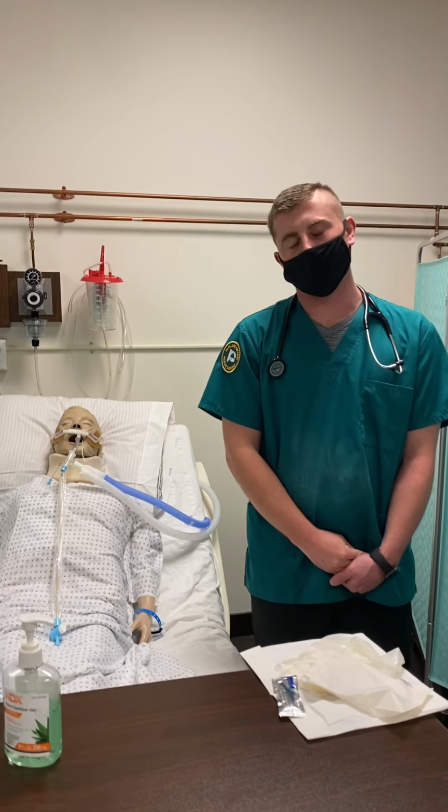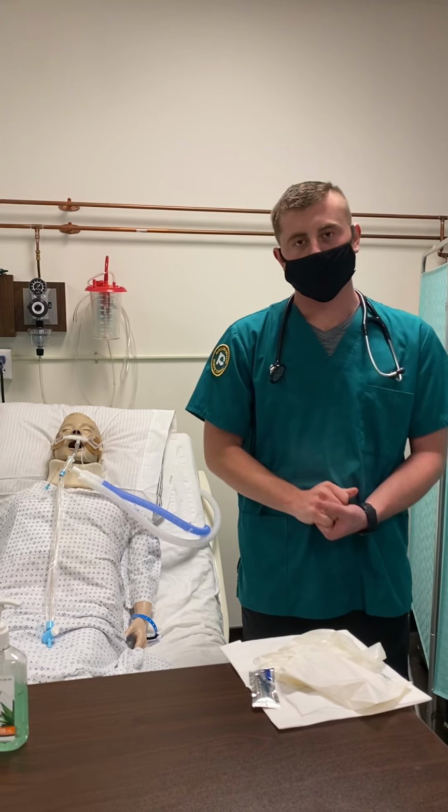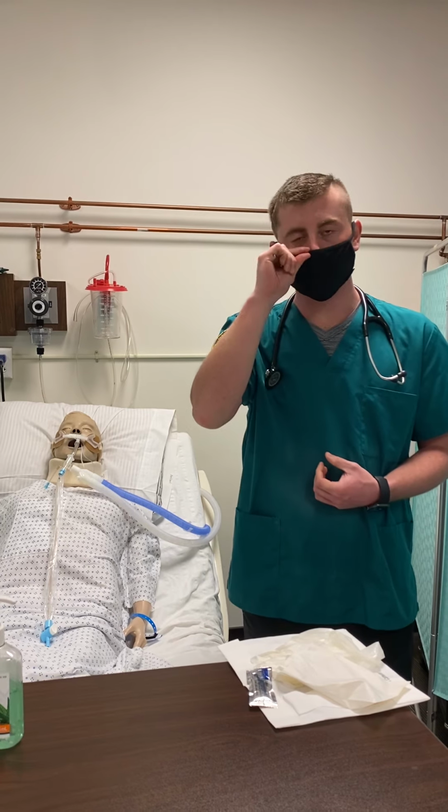Hello, my name is Corbin and I'm a respiratory therapy student at Parkland. This is a competency video for the nasotracheal suctioning.